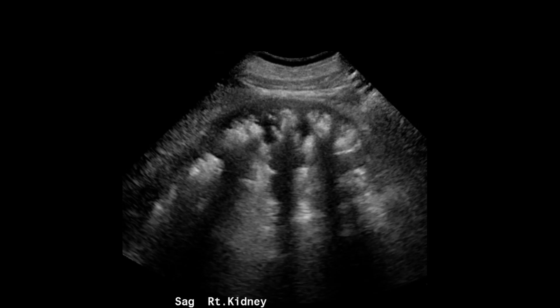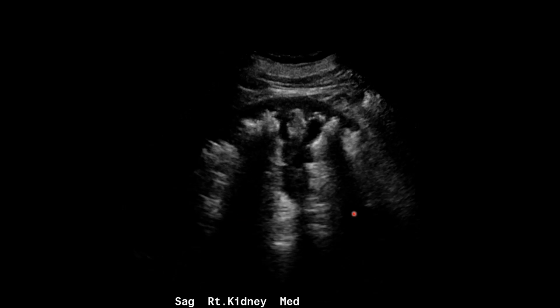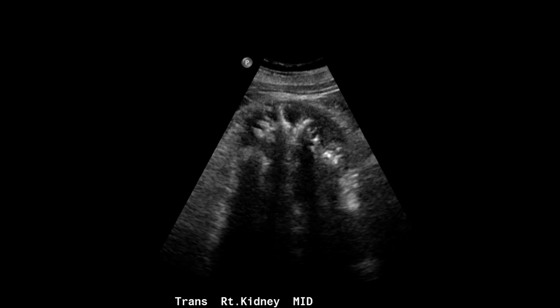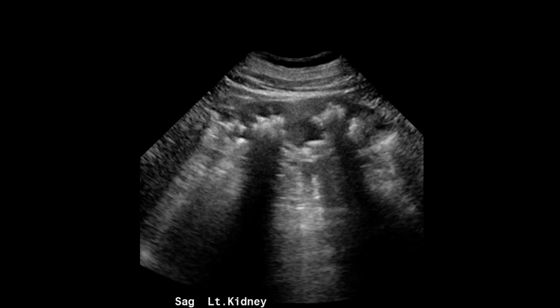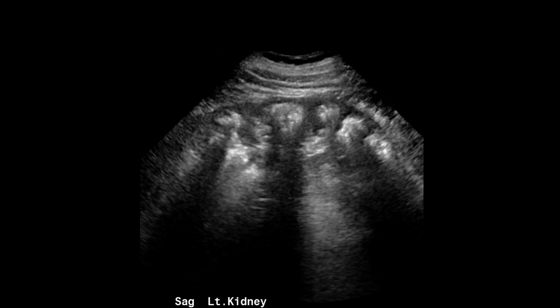We'll start with a sagittal view of the right kidney on ultrasound. You can see here's the liver, and then the renal cortex looks normal, but the renal pyramids are markedly echogenic with posterior acoustic shadowing. We can see just how dense that posterior acoustic shadowing is on this image, and we also see that on the transverse images of the right kidney. The left kidney looks similar — the renal cortex is normal, but we have these really echogenic pyramids with posterior acoustic shadowing.